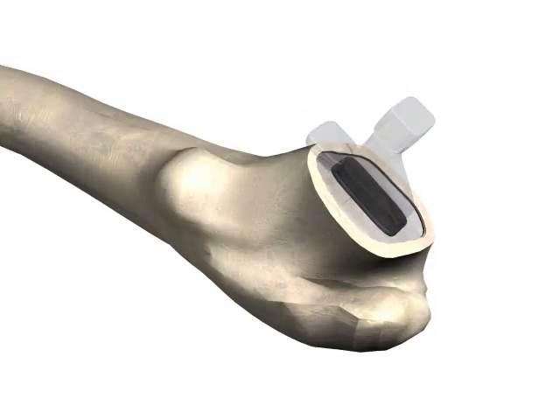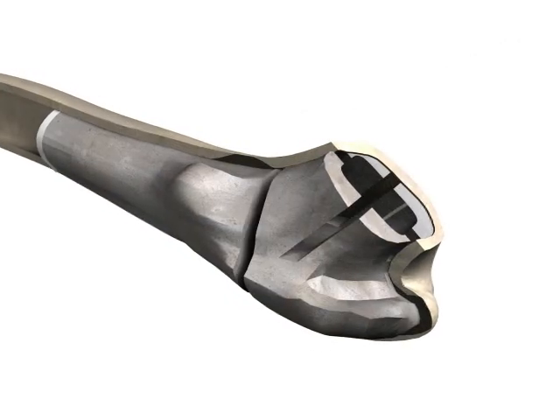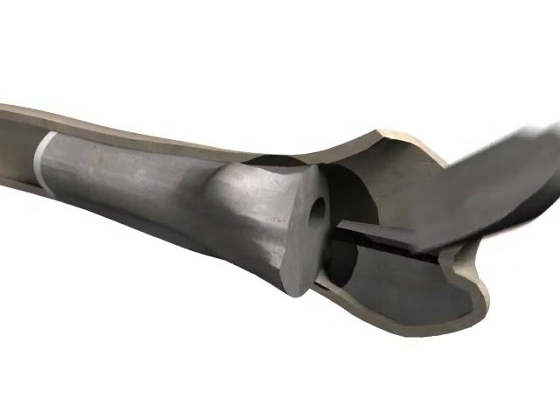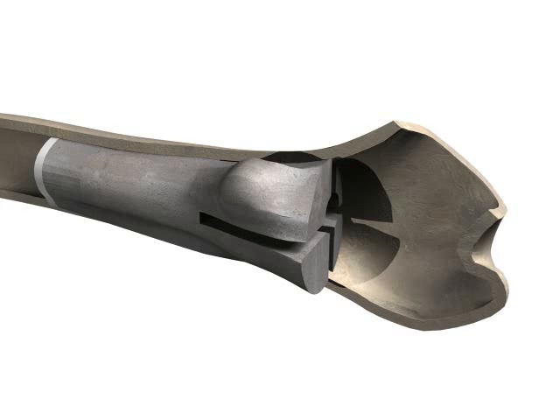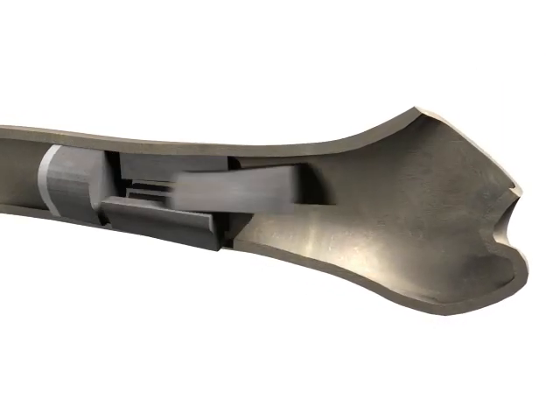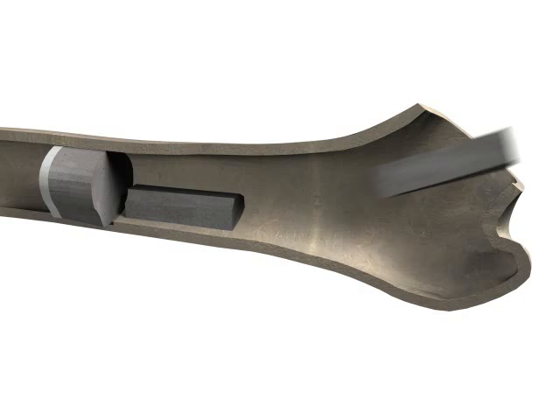Oscar probes are designed to be used intermittently to remove small sections of cement. By using the scraper and Groover probes, these sections can then be joined to weaken the structural integrity of the mantle. The cement can then be removed in larger pieces.